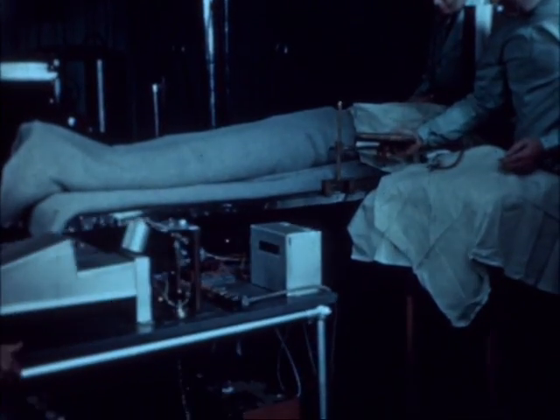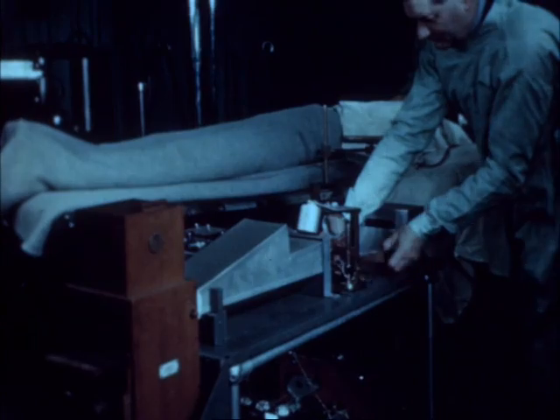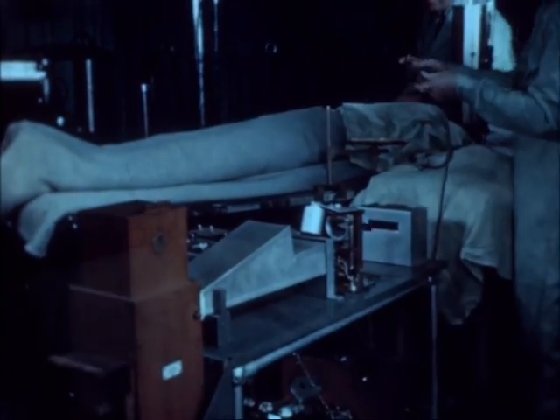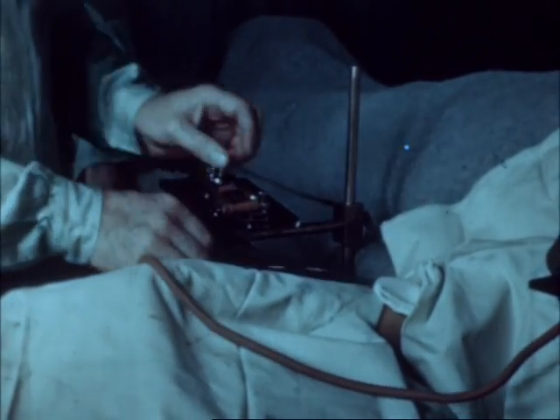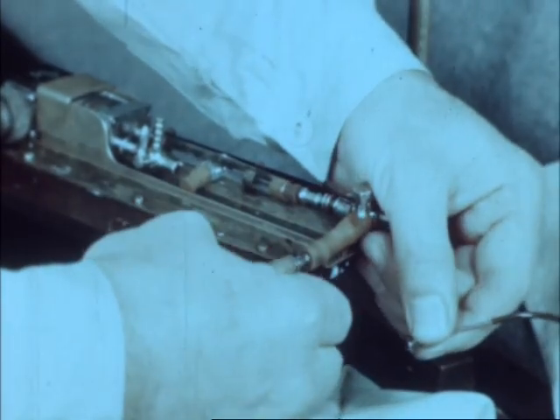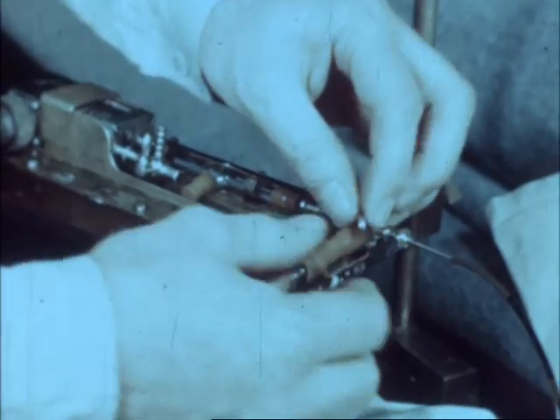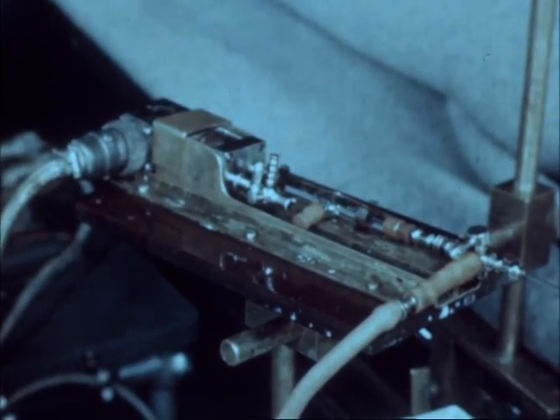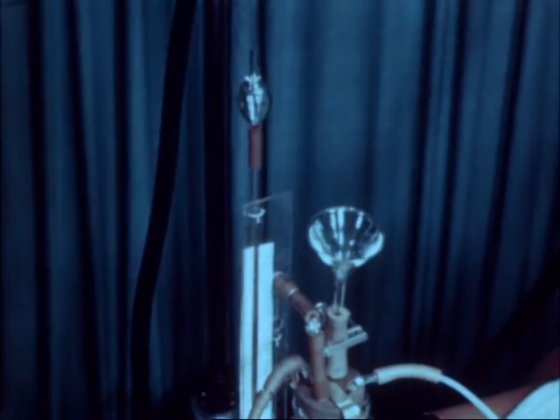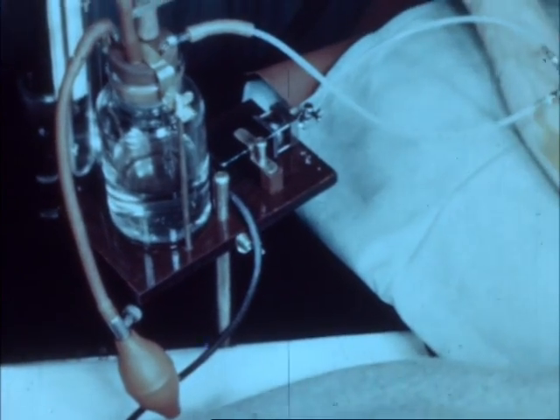The apparatus is mounted on a wheeled trolley. The strain gauge is contained in an oblong box with arrangements for fluid transmission of pressures from the heart. A three-way tap permits easy switching to either the saline manometer or the strain gauge. A similar strain gauge may be connected to the indwelling arterial needle in the other arm. It is seen here with its connections mounted on a stand beside a pressure bottle containing sterile saline.